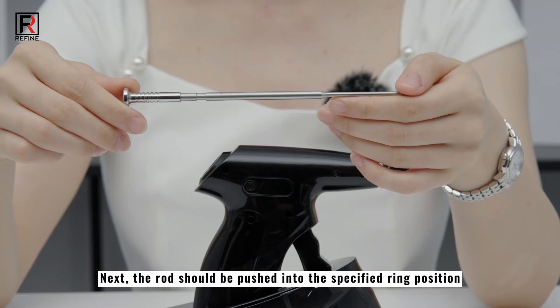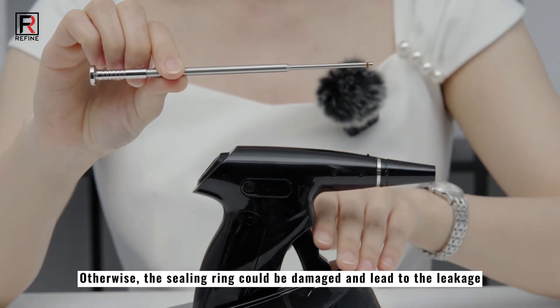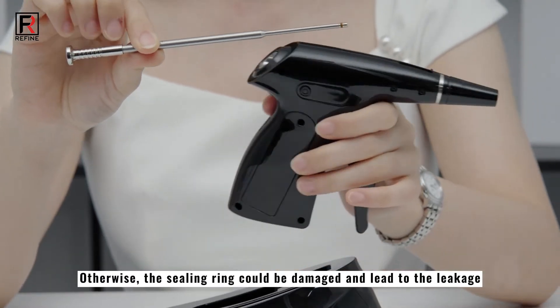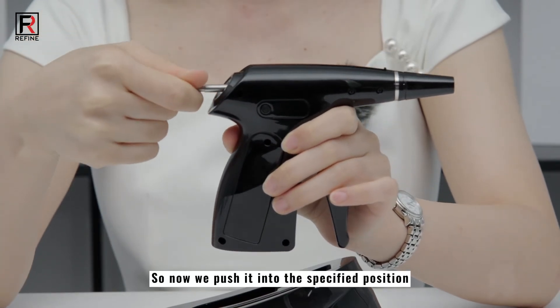Next, the rod should be pushed into the specified ring position. Otherwise, the sealing ring could be damaged and lead to leakage. So now we push it into the specified position.